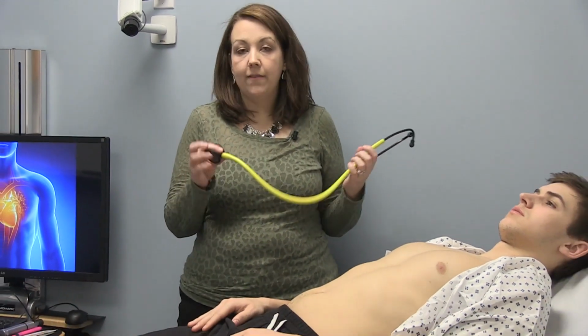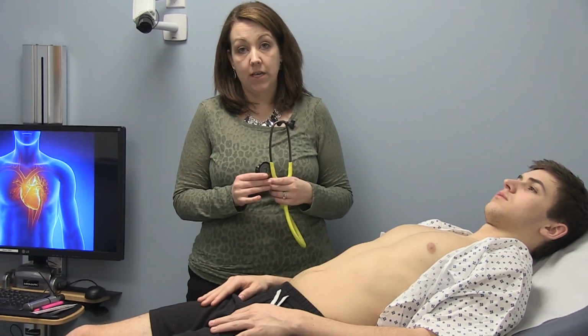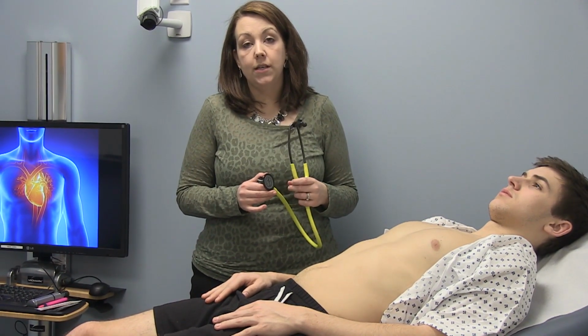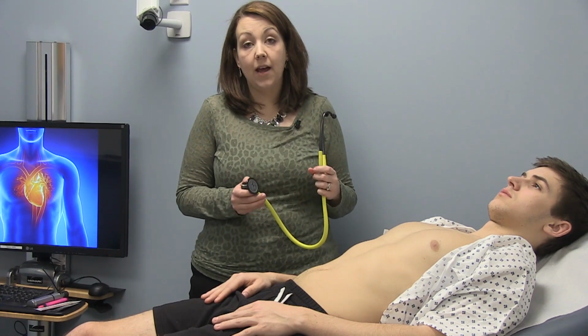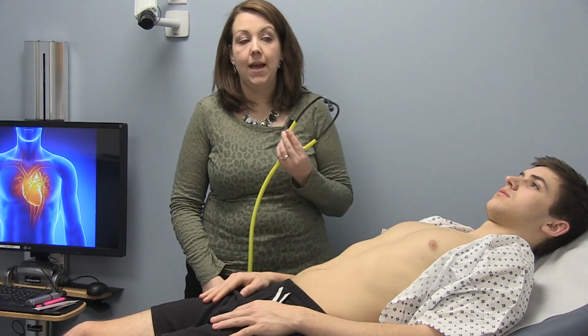The next step is auscultation, and we will auscultate in each of the same 5 regions. We'll use both the bell and the diaphragm to hear both high and low heart sounds. Now your stethoscopes all have the tunable diaphragms, and so you do not have to switch sides in order to hear both the bell and the diaphragm. You can do that just by changing pressure of your stethoscope. However, during the checkoff, you do need to verbalize that you are listening with both the bell and the diaphragm, because whoever's watching you will not be able to tell that just by looking at you.